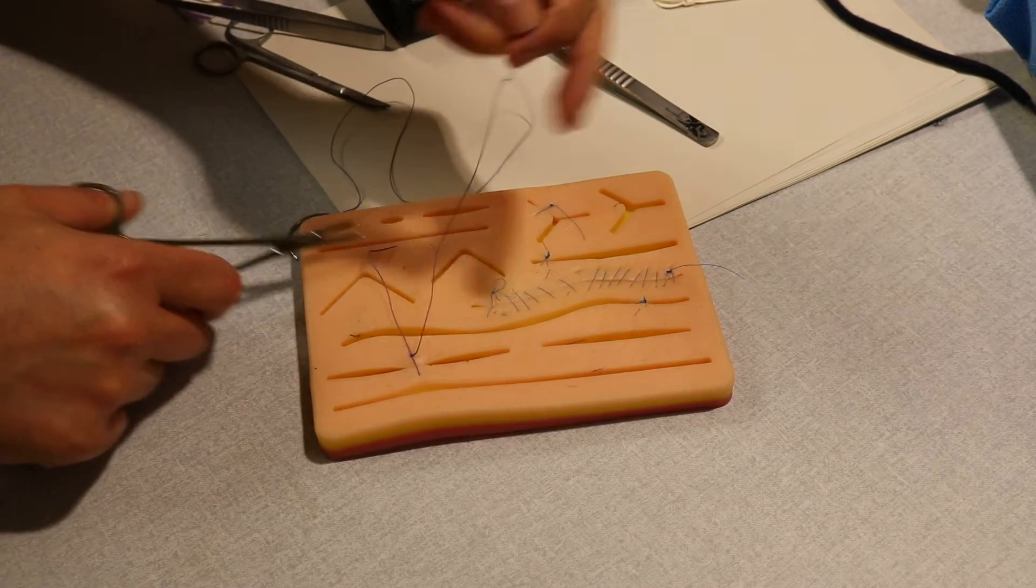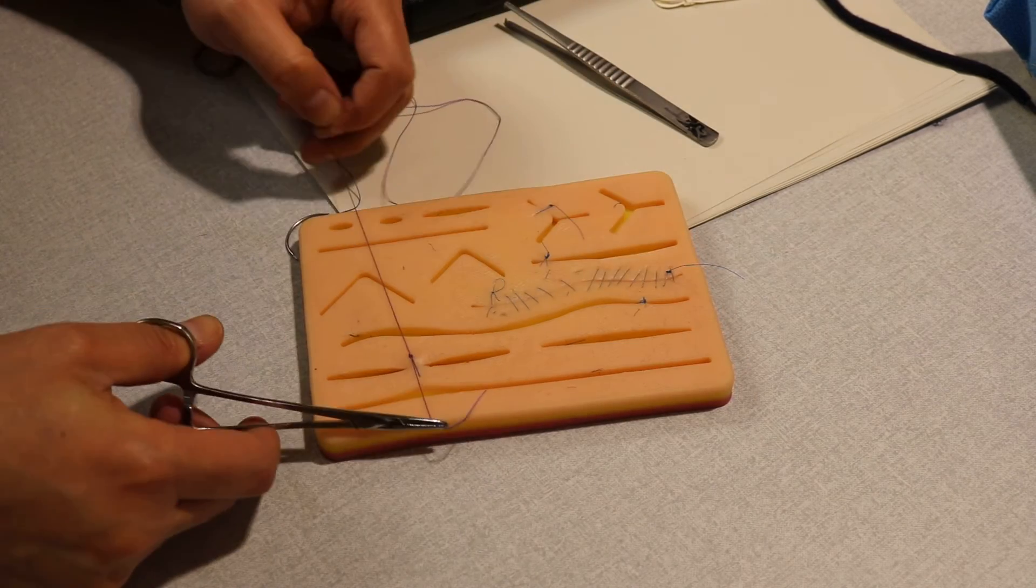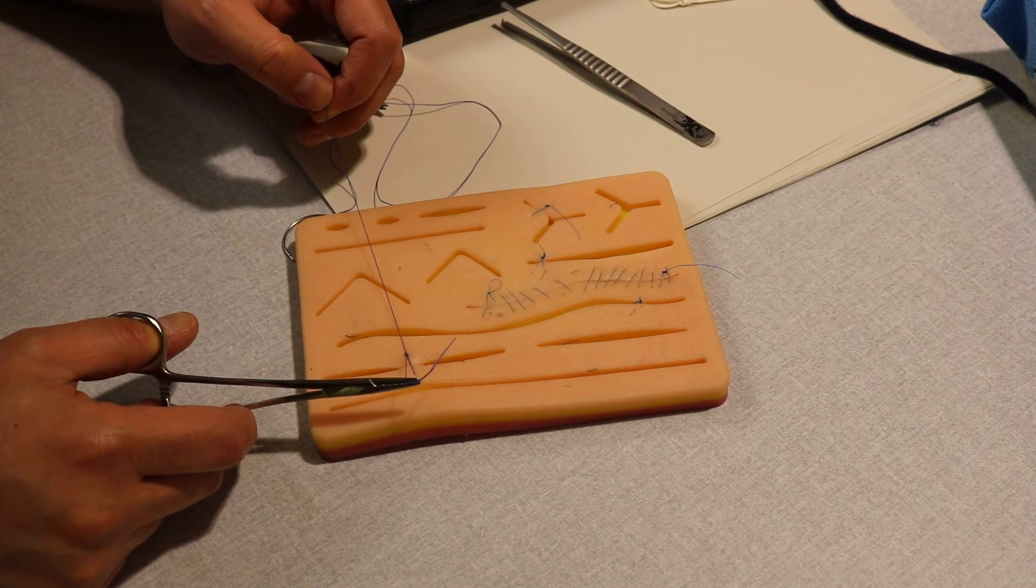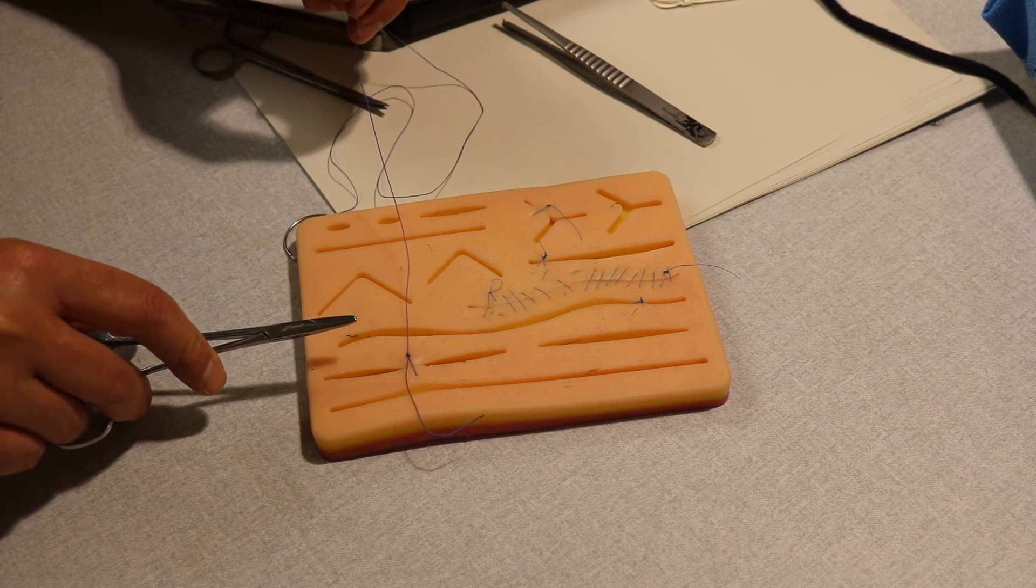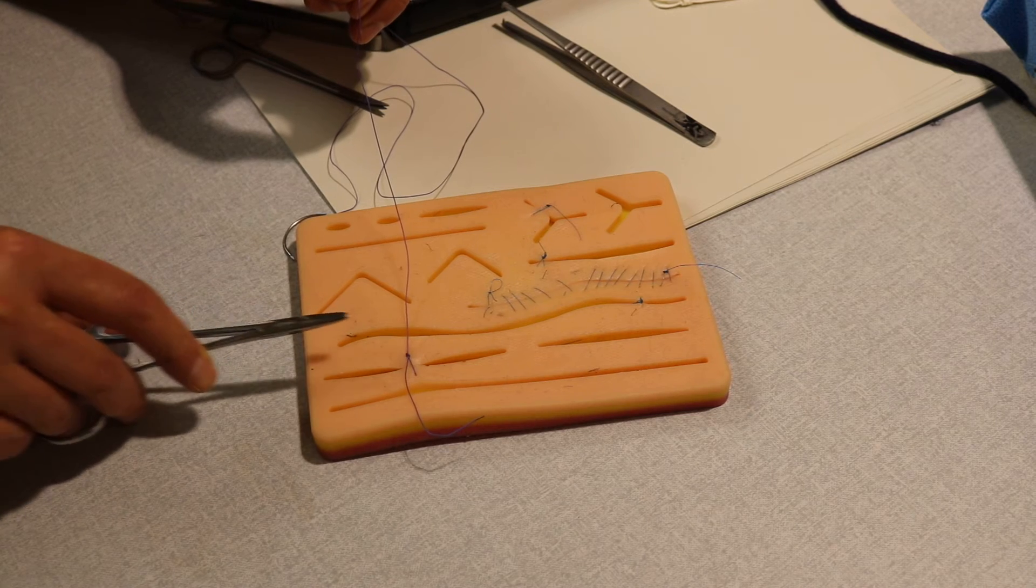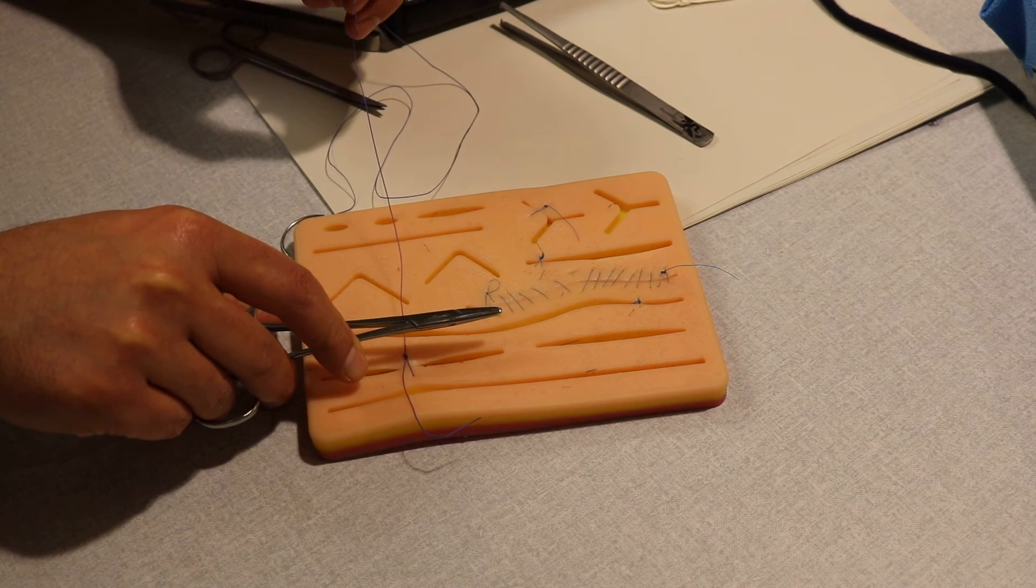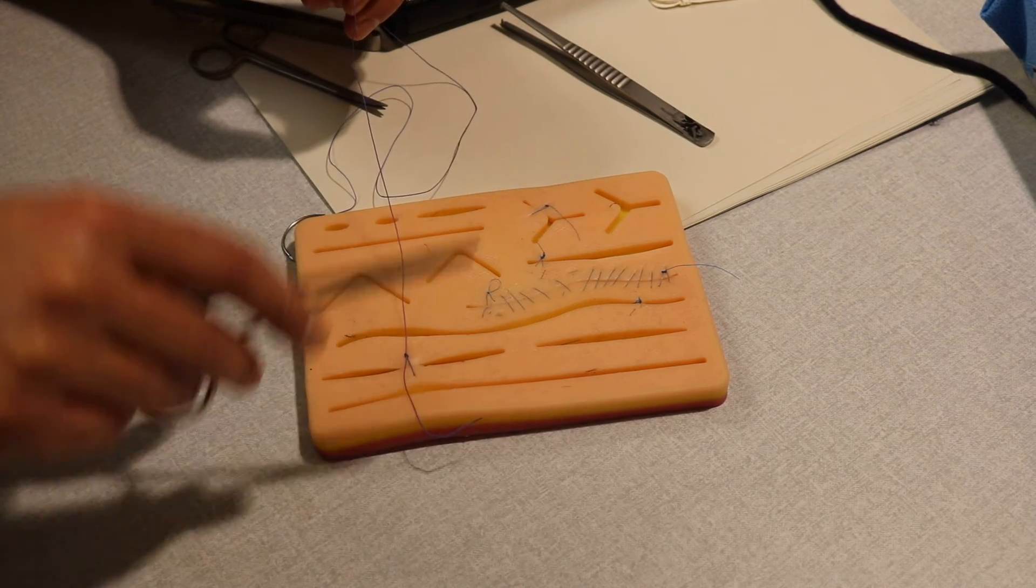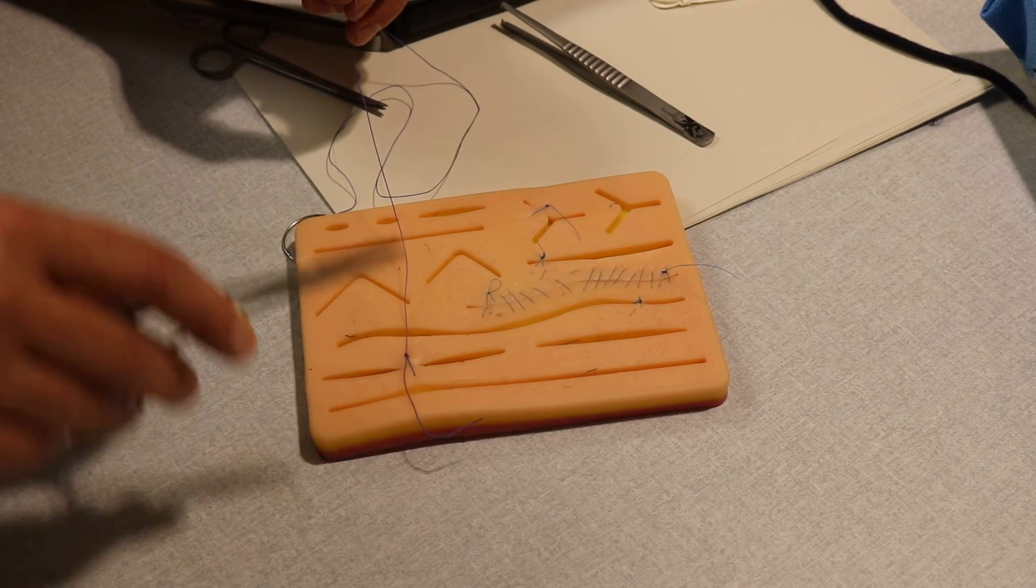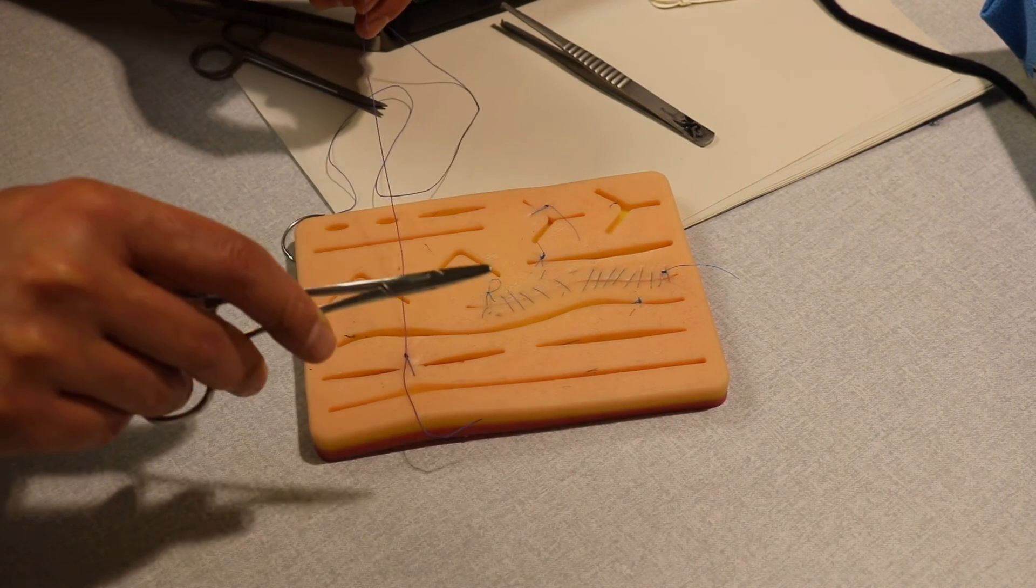We'll just do it again and again, but I've done the first one. The third one will be the same as exactly the first one. The right goes to the left and the left goes to the right, the far goes to the near and the near goes to the far. I'll show it again.